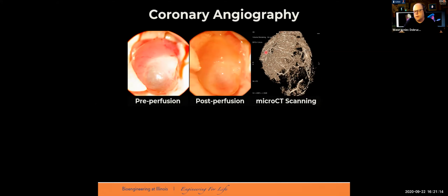So it requires a lot of processing to get some information. But those advanced workstations had very specific algorithms for cleaning up the image and producing images that we can use for presentations or quantification.